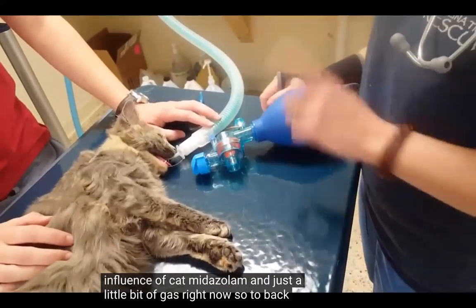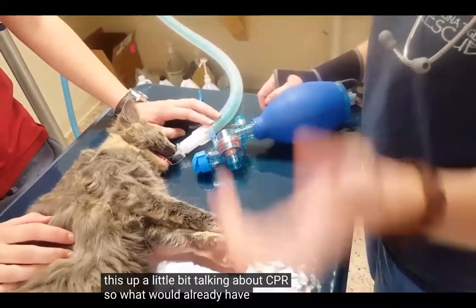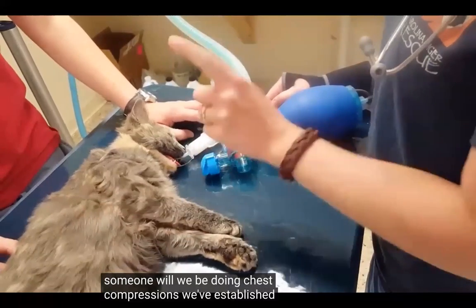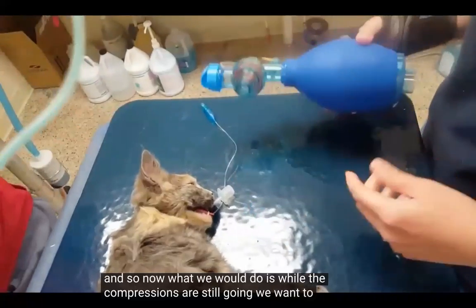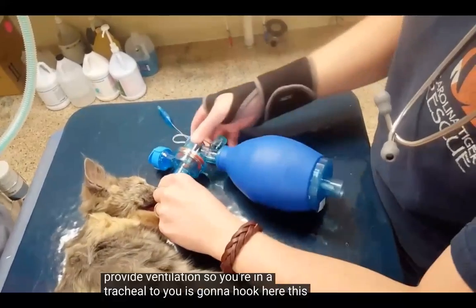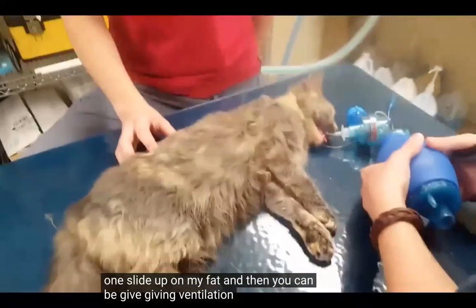So to back us up a little bit, talking about CPR, what would already have occurred is someone would be doing chest compressions. We've established an airway. So now what we would do, while the compressions are still going, is provide ventilation. So your endotracheal tube is going to hook here. Just slide it in like that, and then you can give ventilations.